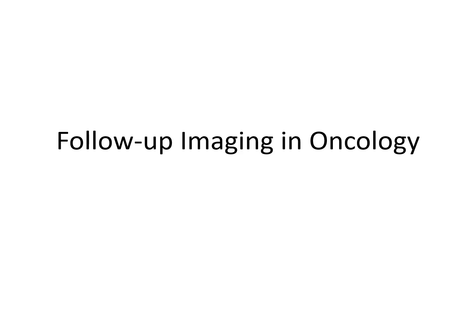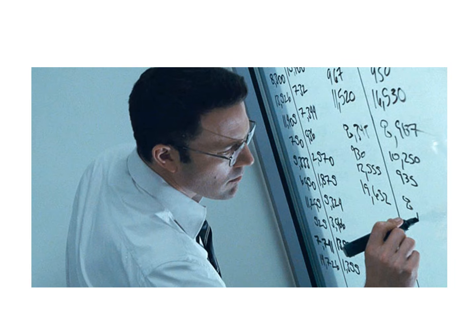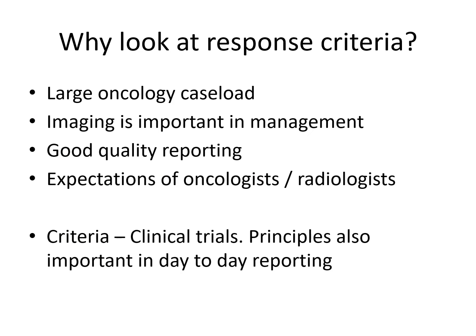So I'm just going to talk in this lecture about follow-up imaging in oncology and how we do it and how we should do it. To begin with, oncology CTs in particular, oftentimes we might feel they're a little boring, lots of measurements, lots of numbers, a little repetitive. And there is some truth in that, of course, but I think we can do it well. We can do it better than we do. I want to look at the response criteria which we can use to sharpen up our reports.